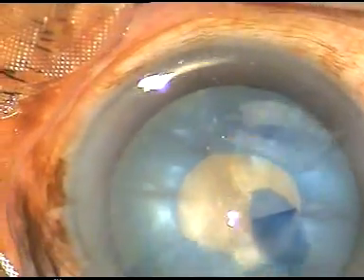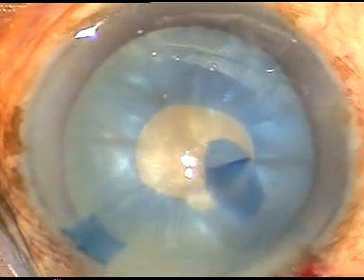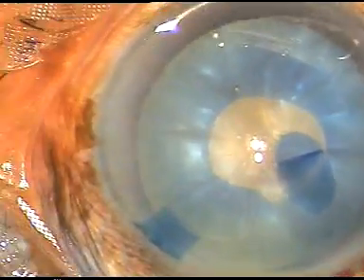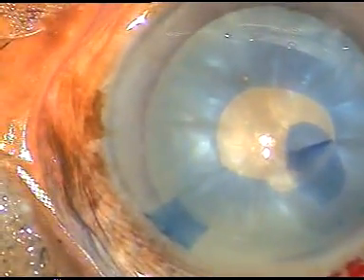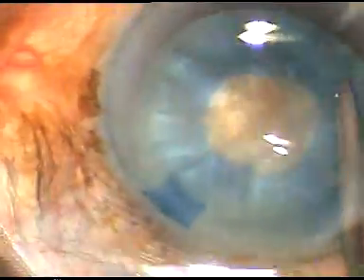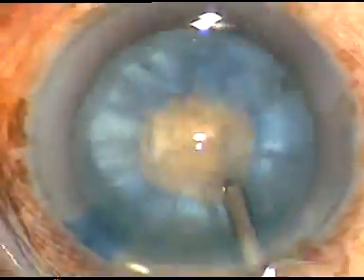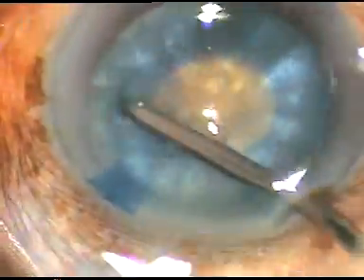And now I have to remove some cortical lens matter from the anterior aspect of the cataractous lens. So in this case I have just irrigated the anterior portion of the cortex. I've introduced this irrigating probe of bimanual IA through the mini rhexis, and you can see that a lot of cortex is getting dislodged and it is coming out through the main incision.